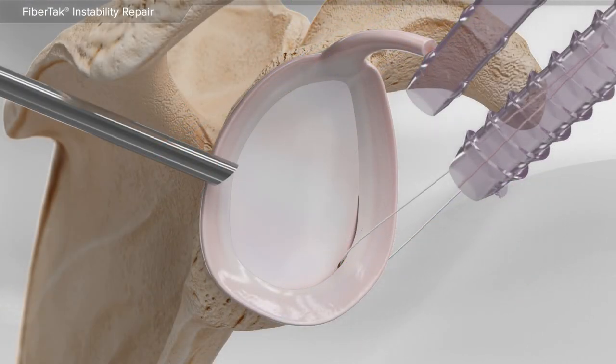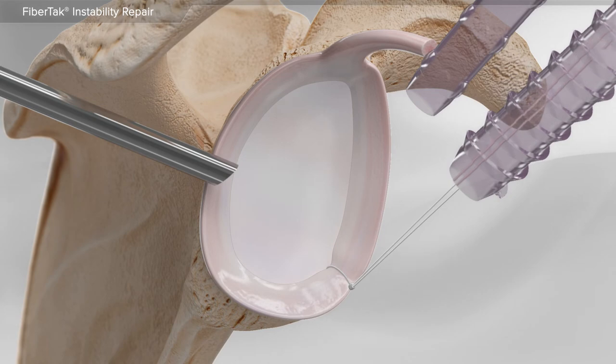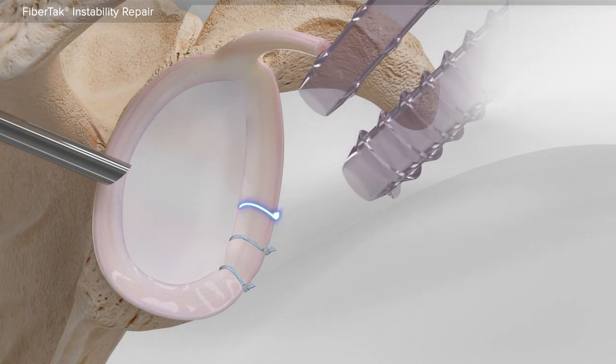Using a series of instruments, one suture is placed through the labrum and tied to the second suture. Finally, the sutures are cut. Your surgeon will place additional suture anchors if necessary. This completes the repair of the labrum in the shoulder.